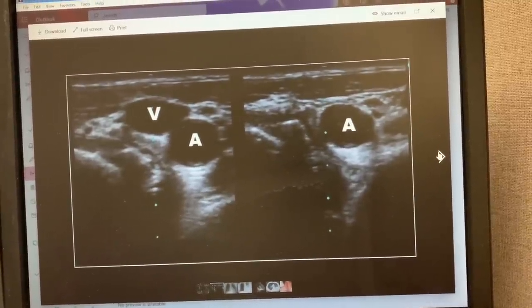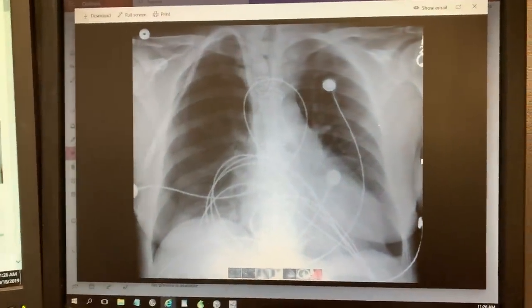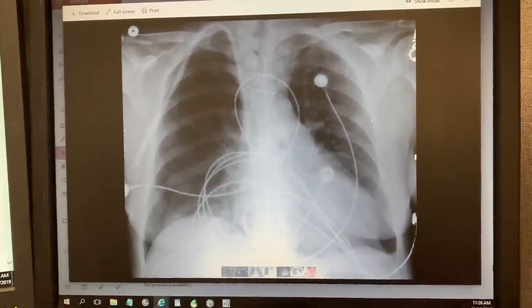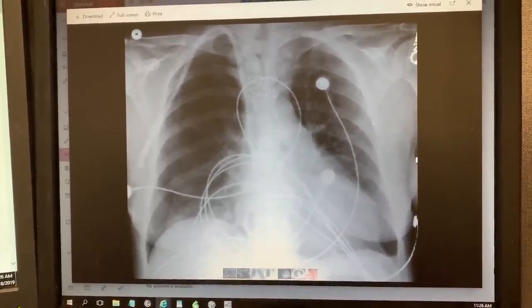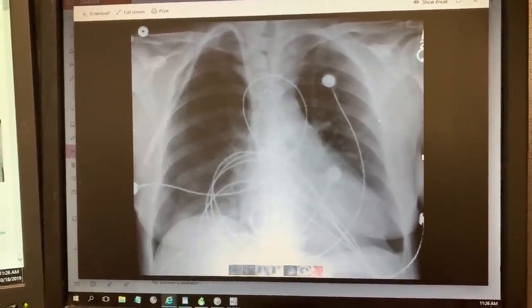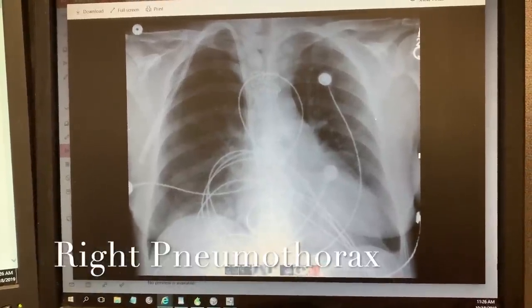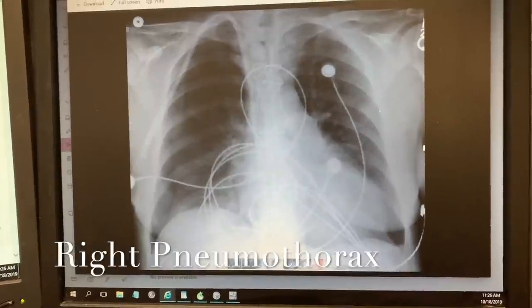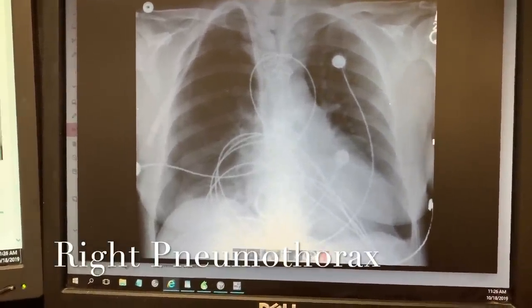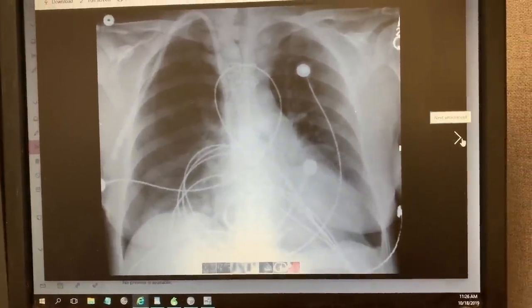Let's take a look at some complications that can happen when putting in a central line. One of the complications is a pneumothorax. That's why after every central line, we order a chest X-ray to make sure there's no pneumo. Right here you see the pneumothorax.